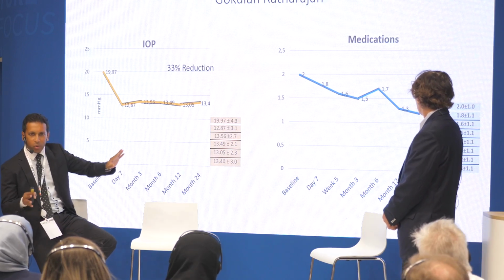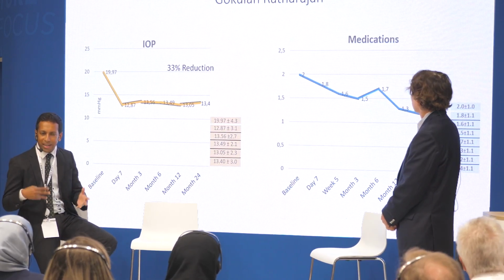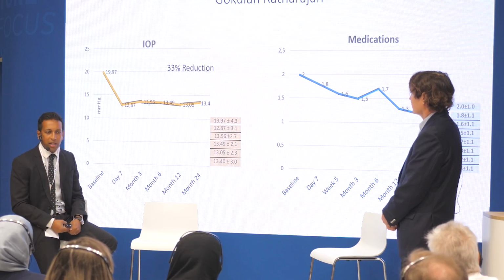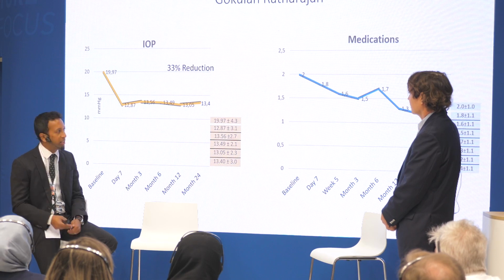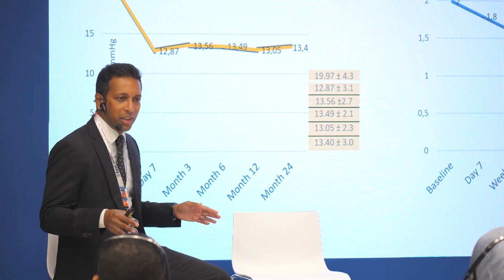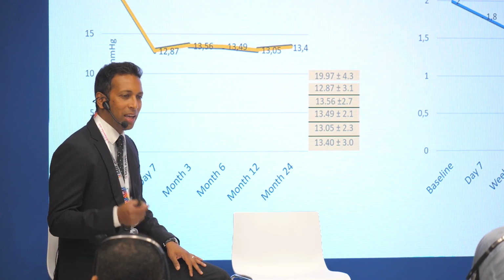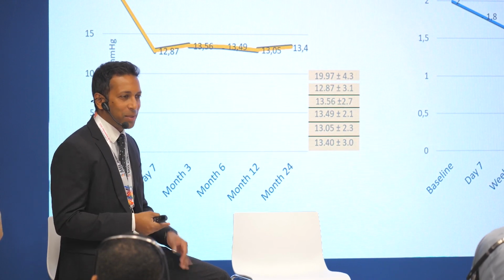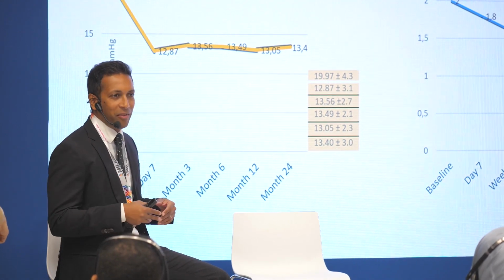When I first started, I was quite conservative about my drop reduction, but now as I have more confidence in the treatment, I'm more aggressive with my drop reduction. And these patients are so smooth in the clinic. It's not like trab patients where you're massaging, doing a suture lysis, doing a needling. You know, these patients come in, you have to see them very rarely.